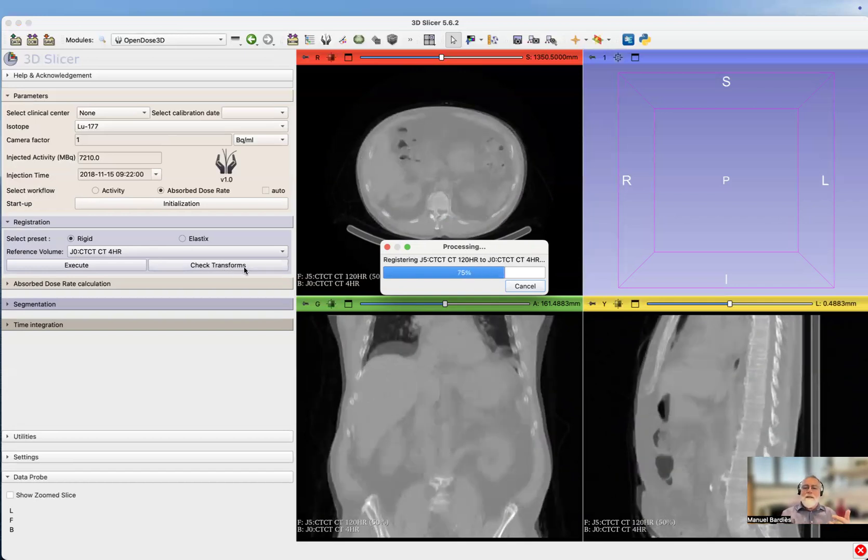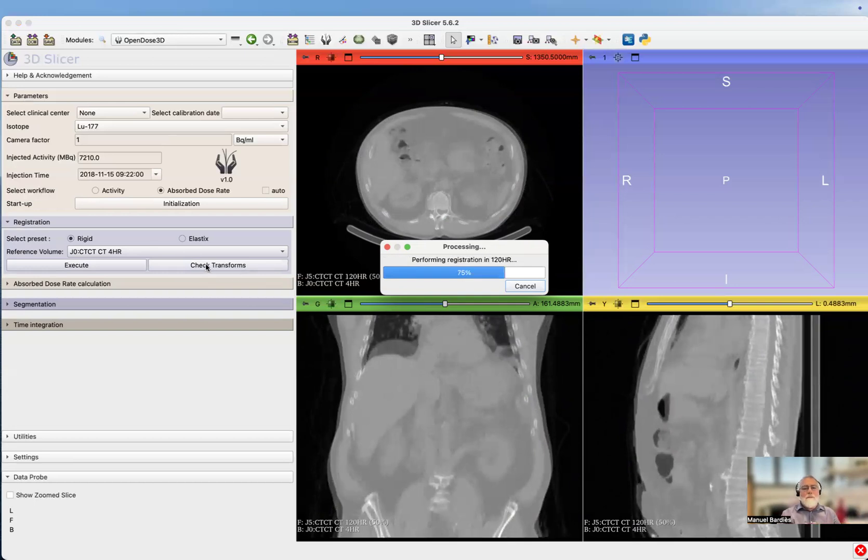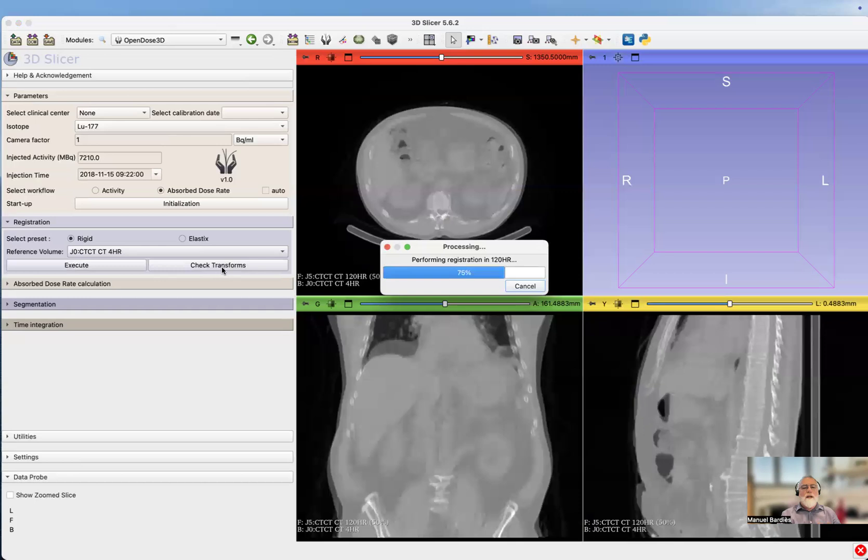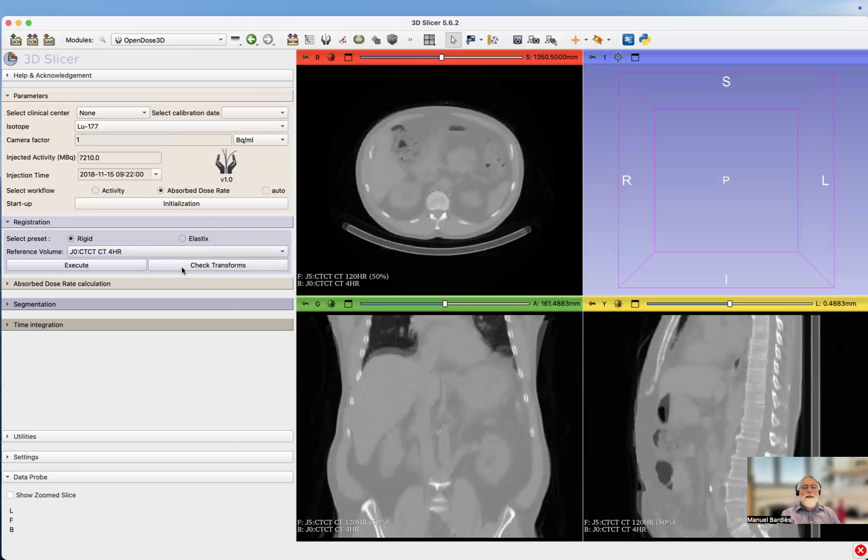When this is done, normally you should check transforms and there will be a specific video on how to check transforms. But for the sake of the first use of OpenDose 3D, we will assume that the transforms are OK. You can see it's done.